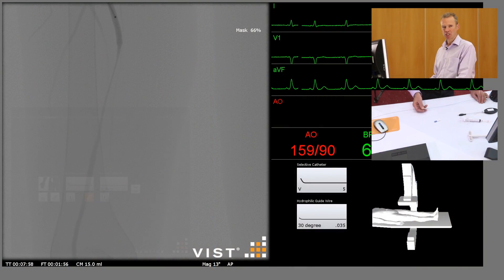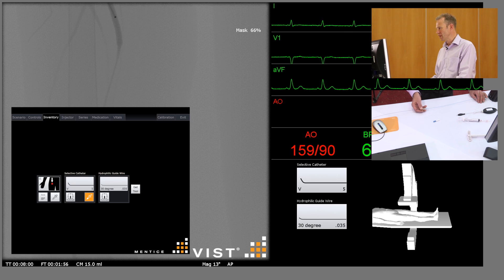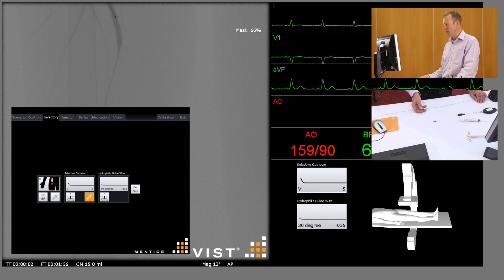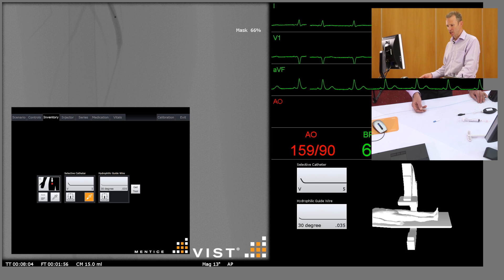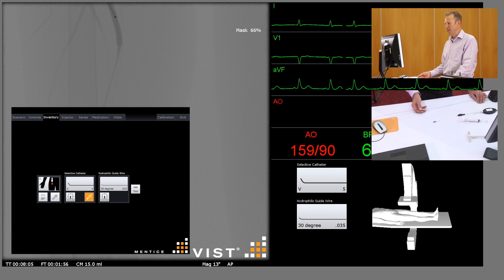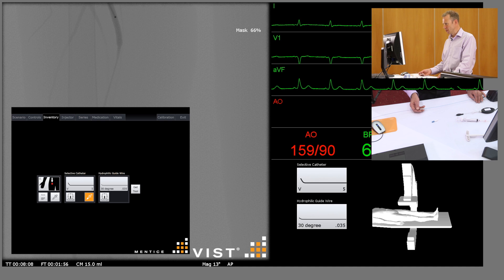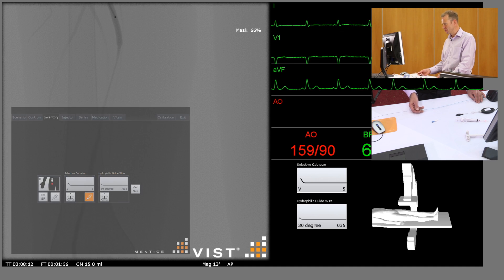At the point we're starting here, we've got an antegrade puncture performed and we've got a six French sheath into the SFA. We have a catheter and guide wire down to just above the stenosis.